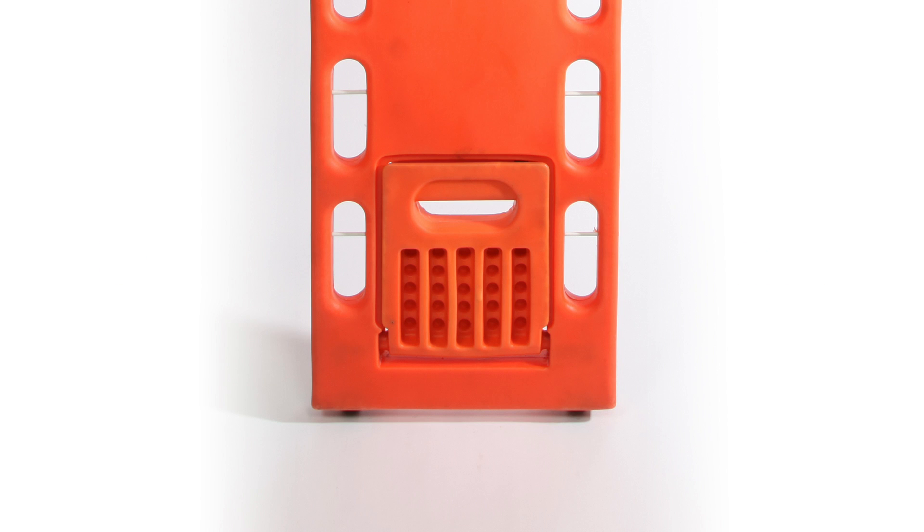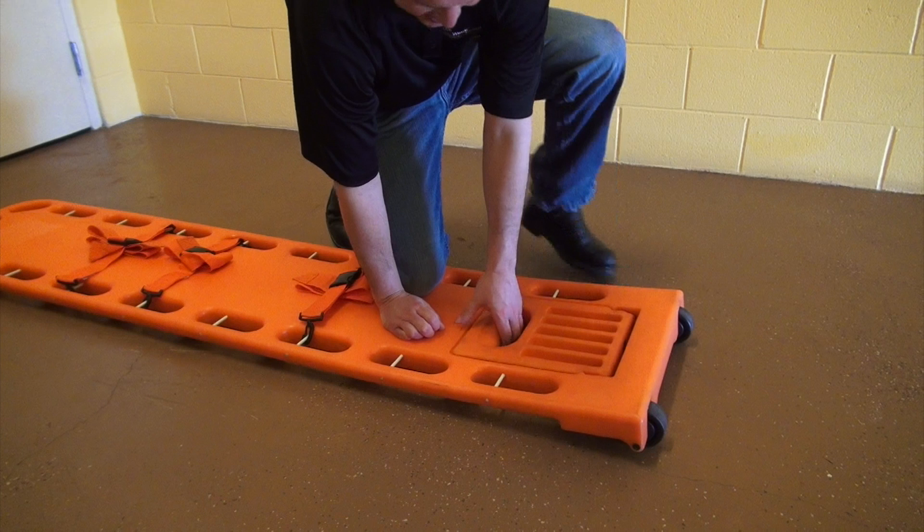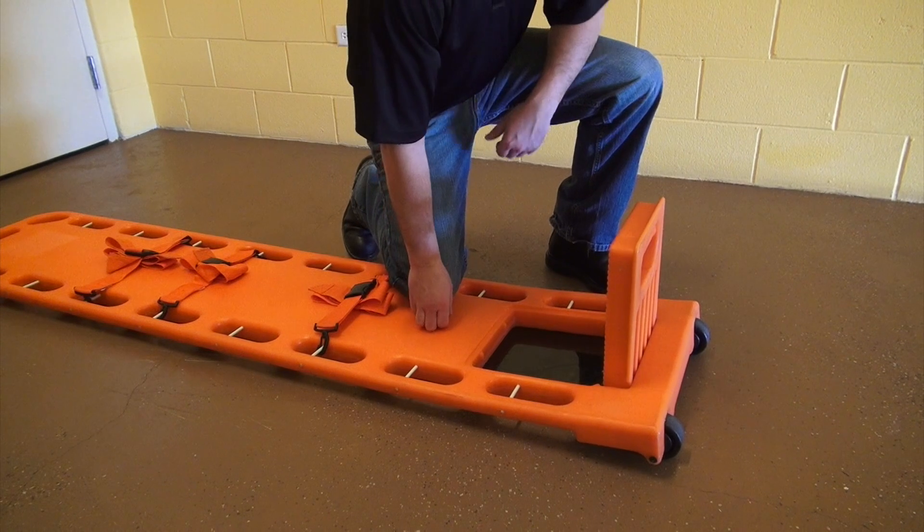To open the footrest, lay the board on a flat surface. Place a knee on the board, grasp the footrest handle, and give the footrest a tug. The footrest will pop out and should be fully open before use.